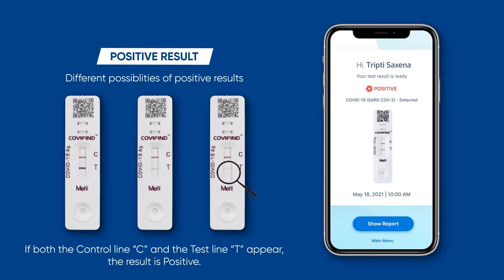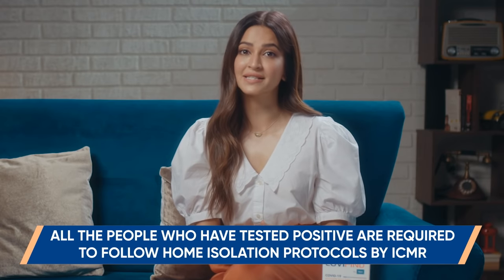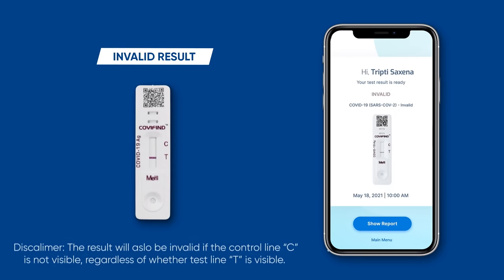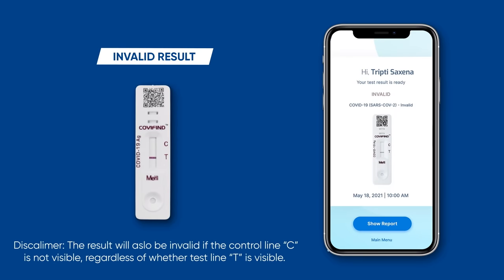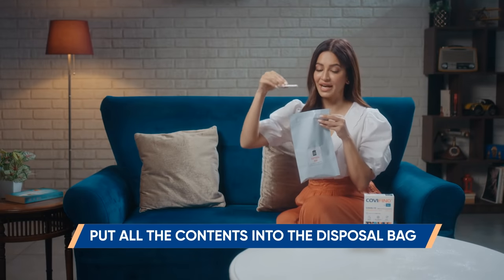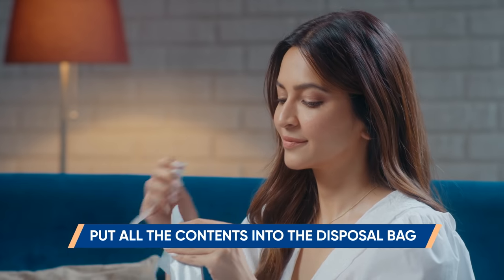If both the control line C and test line T appear, the result is positive. Individuals who have tested positive may be considered as true positive and are not required to conduct the test again. All people who have tested positive are required to follow home isolation protocols by ICMR. Any result appearing after 20 minutes is considered invalid. Once the test is done, put the swab, the tube, and the test device into the disposal bag.